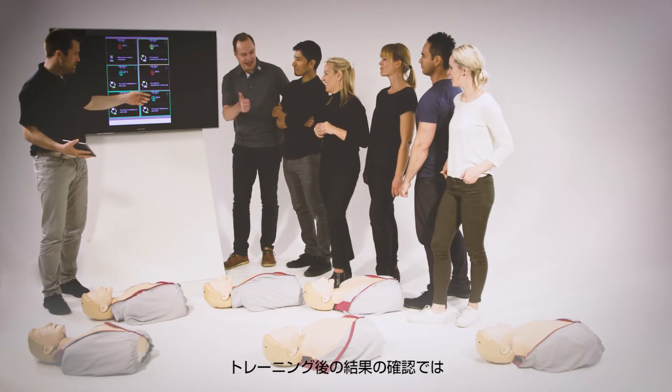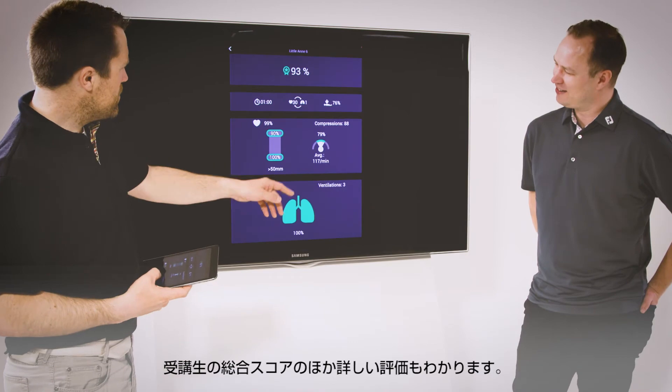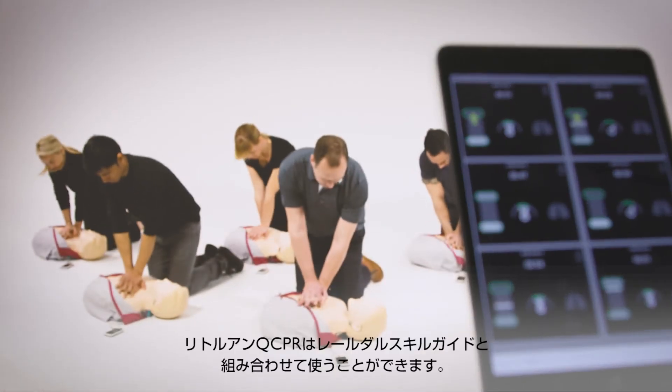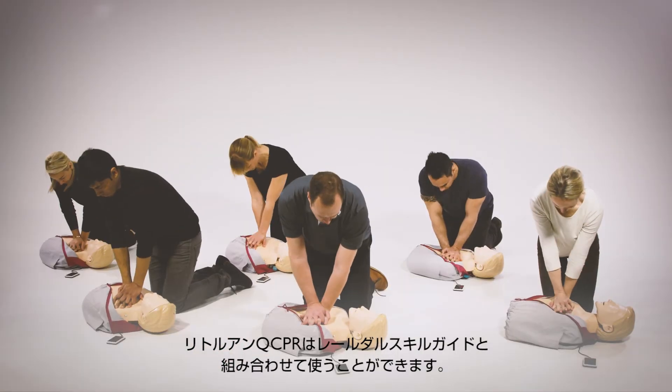During debriefing, students receive an overall score as well as more detailed assessment of their performance. Little Ann QCPR can also be used with the Skill Guide, a lightweight, portable feedback device.